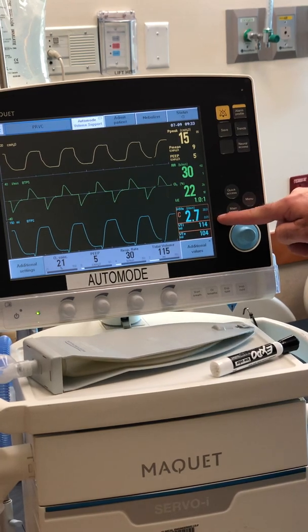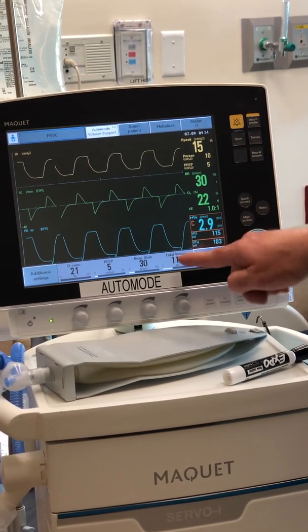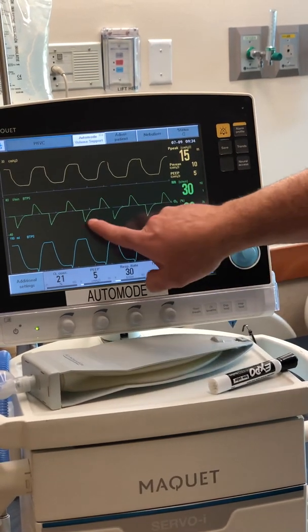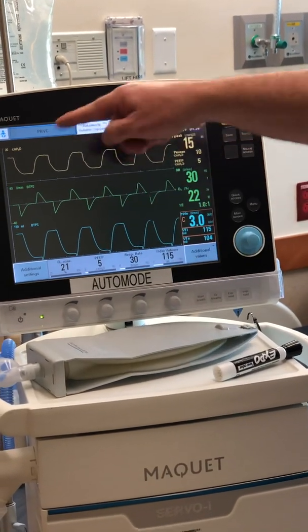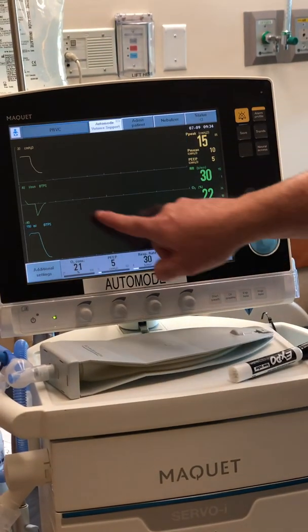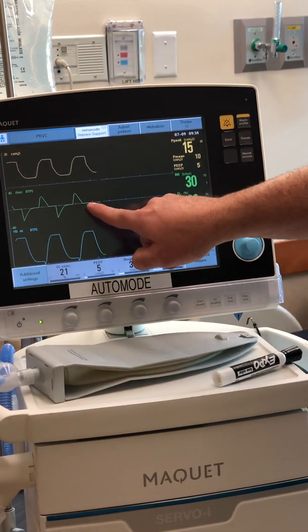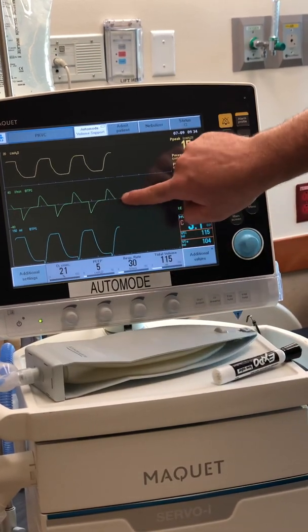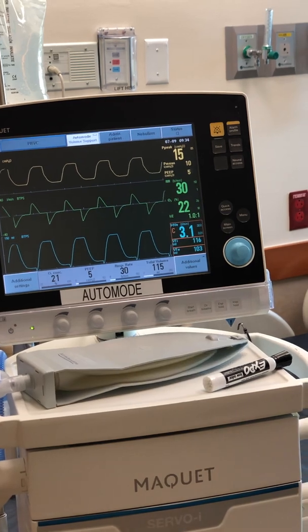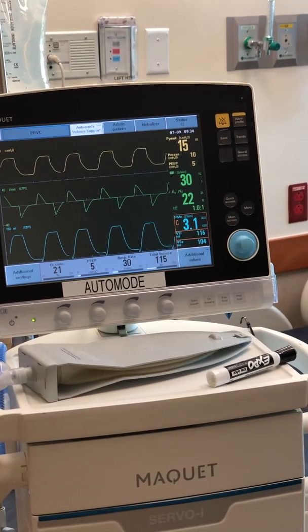The vent adjusts pressure so that 115 cc is delivered on the inspiratory limb. You can see by the waveform that the inspiratory time is a bit long — I have a hold at one second. There are no pink spikes on the waveform, indicating no spontaneous effort detected by the vent. The patient is now in PRVC auto mode but not doing anything spontaneously.